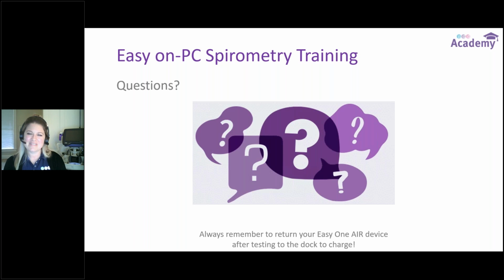And the next question is from Savine. What configuration setting do you use to be able to do the inhalation with the mouthpiece already in the mouth? Wouldn't it stop the test immediately when inhaling instead of exhaling? No. On the FVC, because of how this measurement is taken, it's measured when air blasts through that mouthpiece. On our device, you can have the patient take their big deep breath in, then seal, and then blow. But we've just found there's a lot less error on the patient side when they perform the entire maneuver in their mouth. So that first deep breath in, it's not going the correct direction to end the test. The test isn't going to start until that blast out goes through the ultrasound sensor.